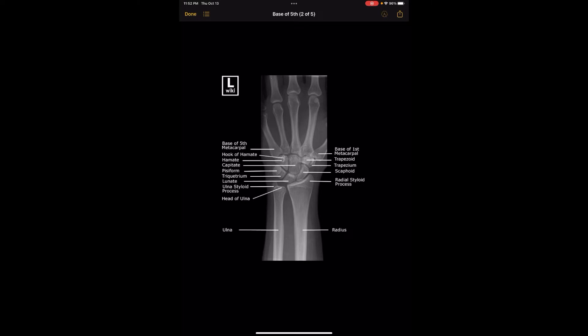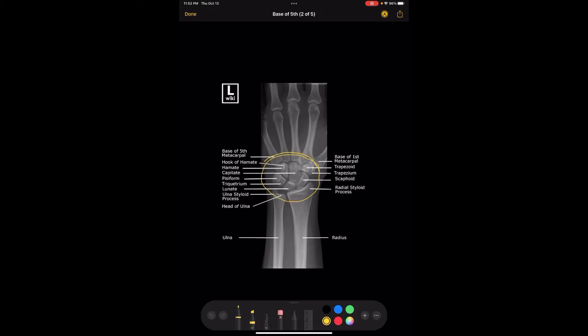I'm just going to click on here and start making notes. This is the most important part of the wrist. When you're doing a wrist, we're also wanting to look at the metacarpals, and also this is the ulna and the radius. According to Merrell's Atlas, you would usually like to have about 2.5 inches above and below the wrist area, and then about 1 inch on the sides so that you can see everything nicely.